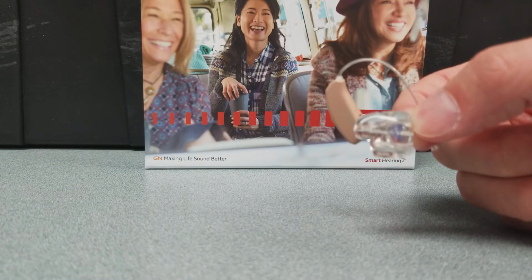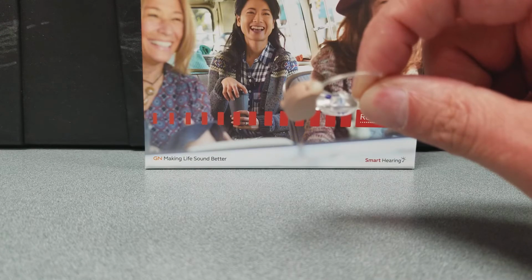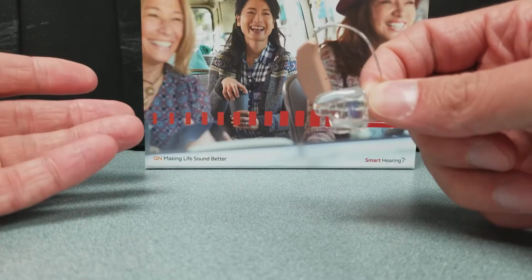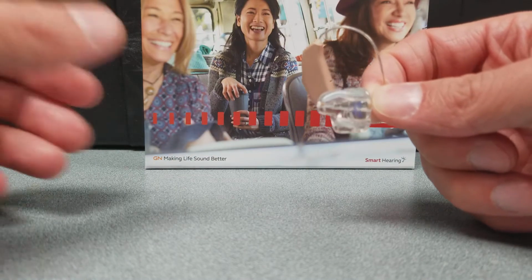Now, to tell your hearing aids left from right, you're going to notice that there's a little bit of coloring. You notice there's a little blue dot right there. Okay. That blue dot is basically the indication of telling you what ear it goes into. Blue stands for left. The other side will have red writing. Red stands for right. Okay.